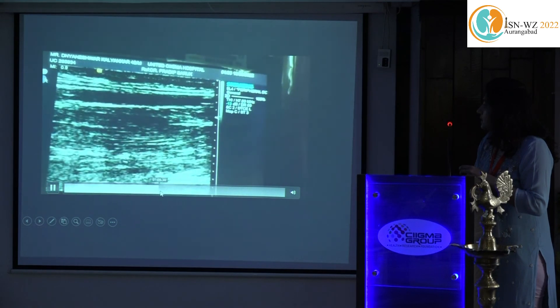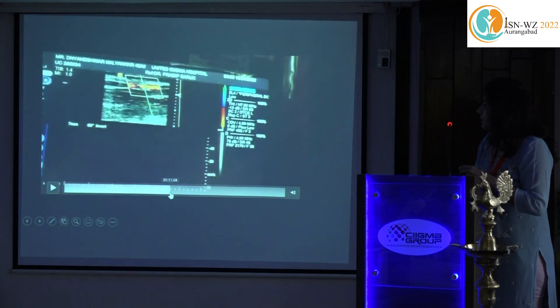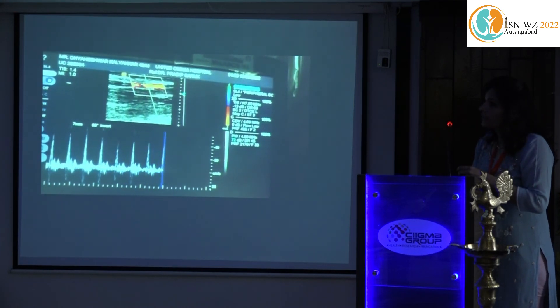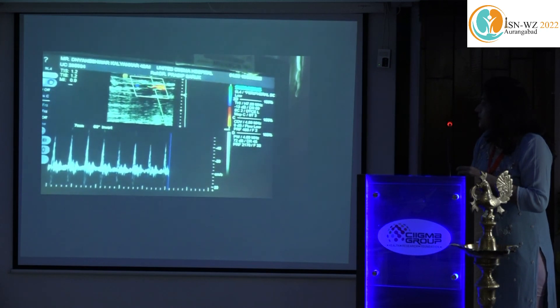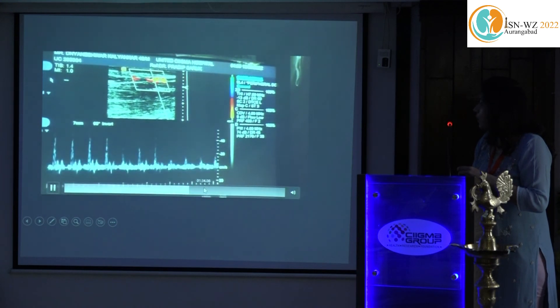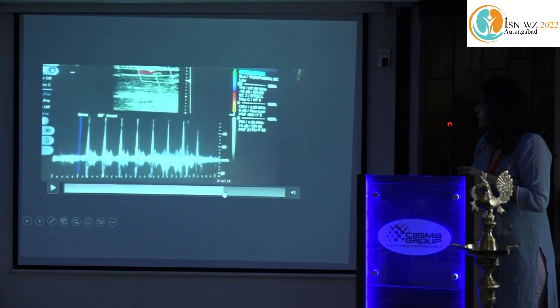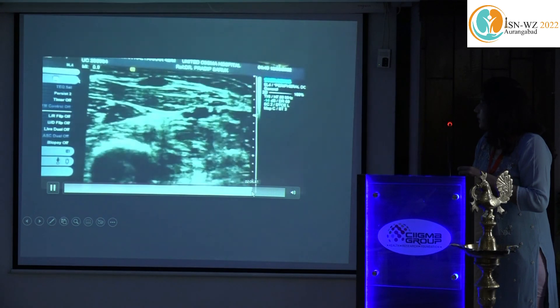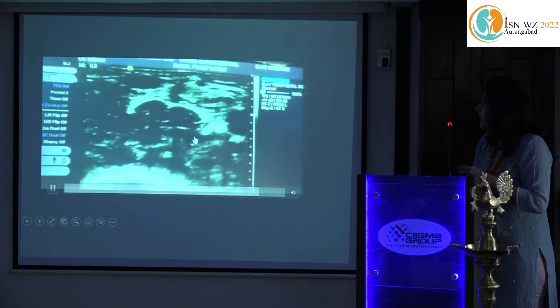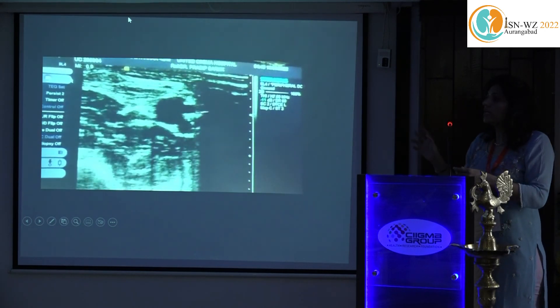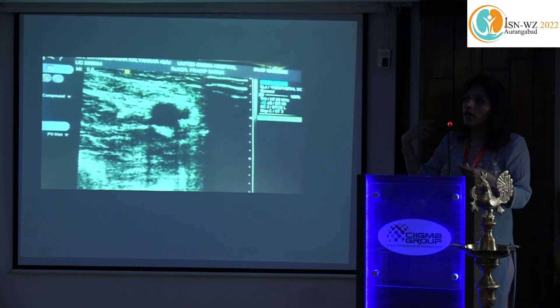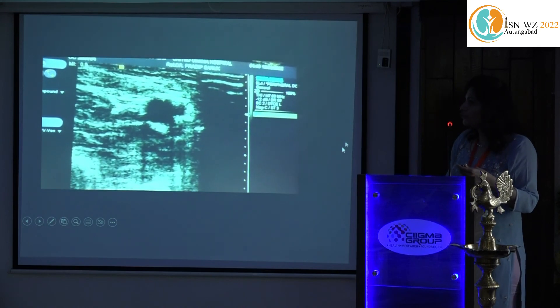This is the longitudinal scan of the artery with color Doppler applied — a normal triphasic flow is seen. While doing this, you can check for the hyperemic response by asking the patient to clench the fist and observing a good increase in flow. From here, we go ahead and evaluate the arteries at the elbow — moving from the radial upward to the brachial artery. One important thing: mention any anatomical variants, such as early arterial branching at the arm level. Thank you so much.